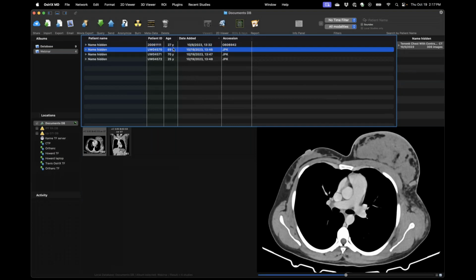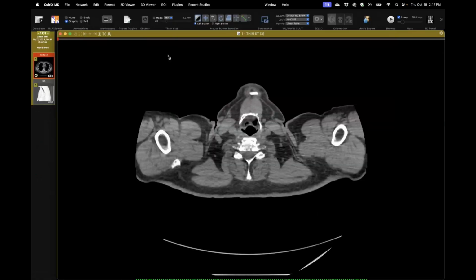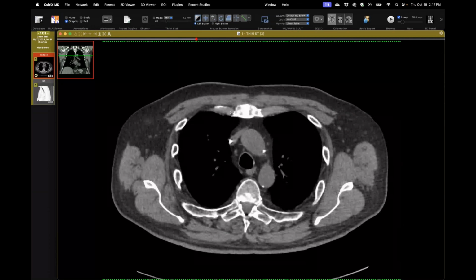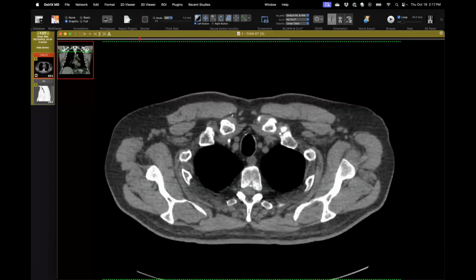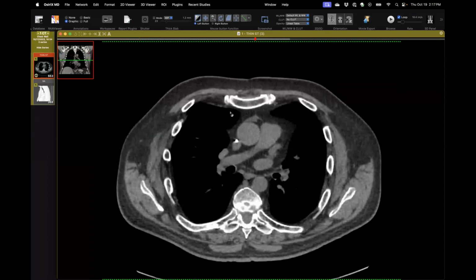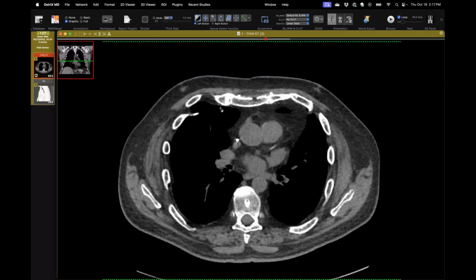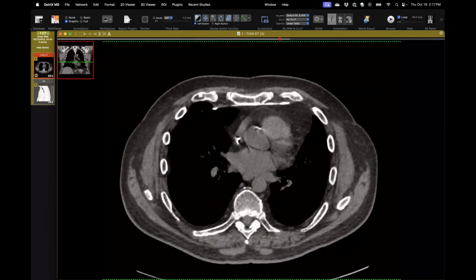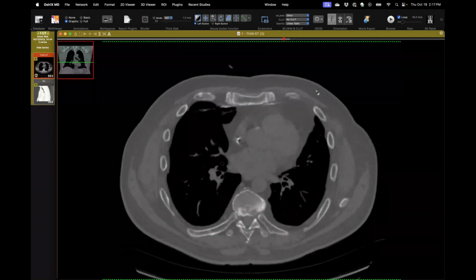I'm going to show this case last because it's the most complicated. This was just kind of a cool case, and I've not seen this. Yeah, this is a 70-year-old guy. He's being treated for a cancer. But what caught my attention was this bright white thing crossing from one rib through the retrosternal space to the other side there. And at first I was wondering, was this a staple line? But it didn't make sense.